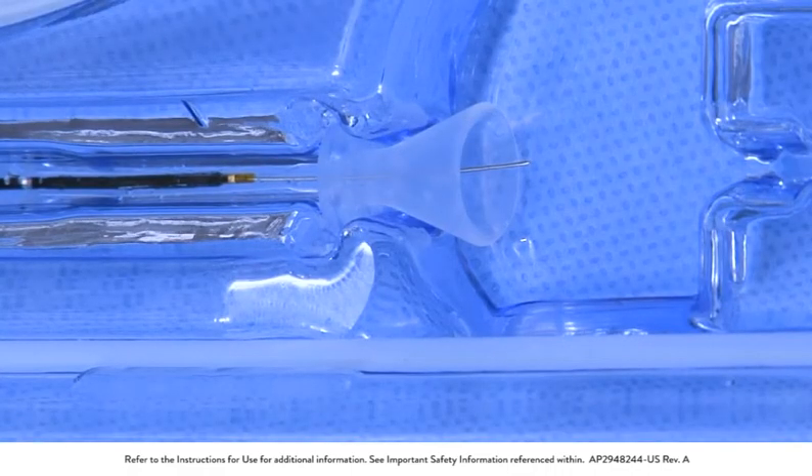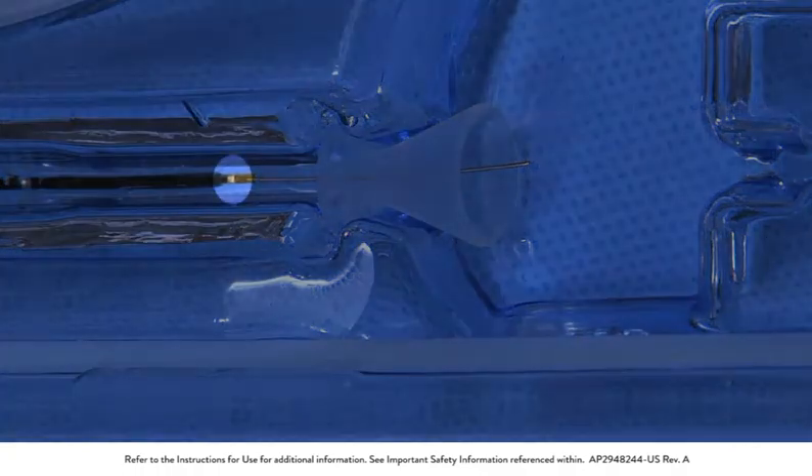The filtration element is fully loaded when the distal marker band is at or inside the end of the delivery catheter pod and a definite stop is felt.